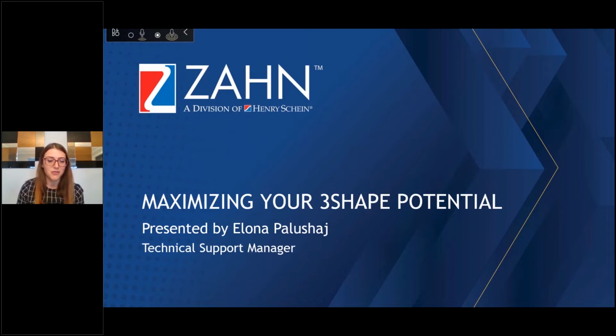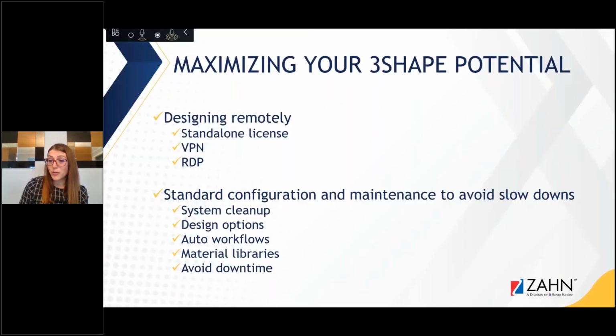Today, we're going to cover one of the topics that comes up the most, especially when we receive phone calls from customers, but I also see it being asked in a lot of the dental portals as well, and that is designing remotely. There are multiple ways of designing remotely, whether you're opening a new office across the country, or you have to quarantine for 2 weeks with everything that's going on right now. This is definitely a good option to have and use.